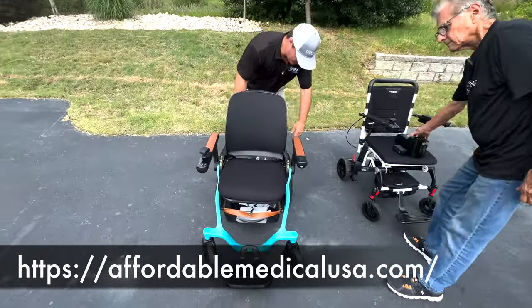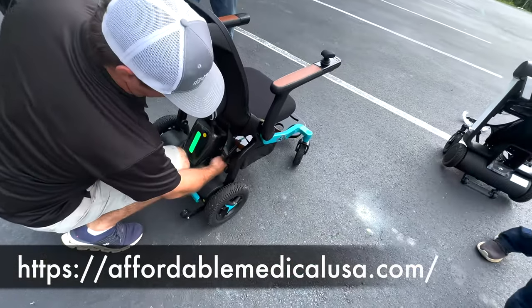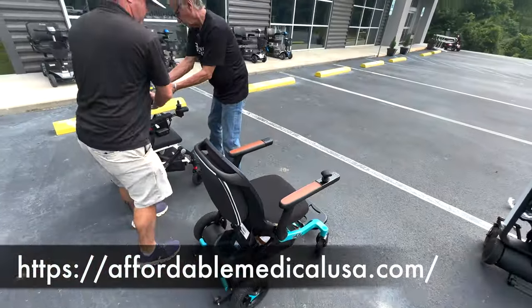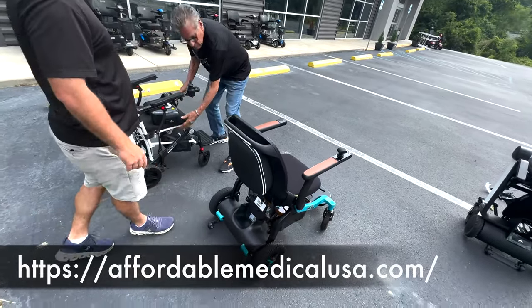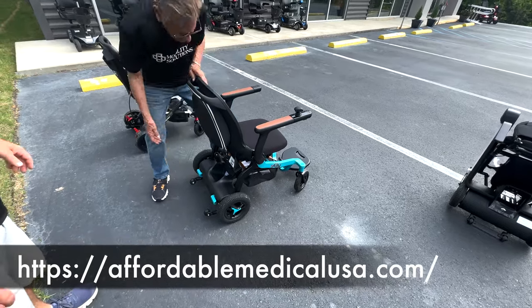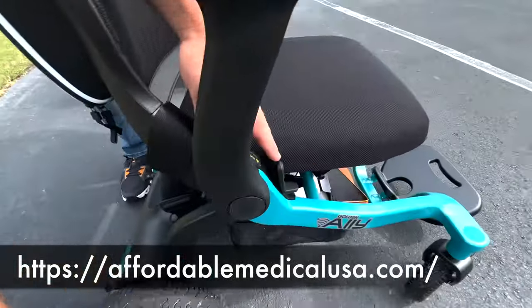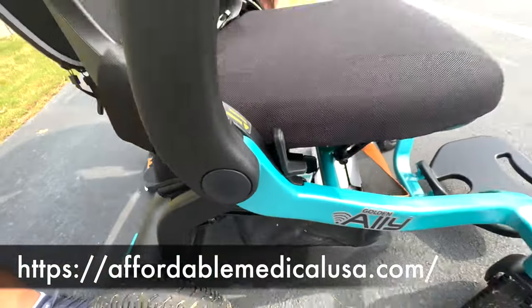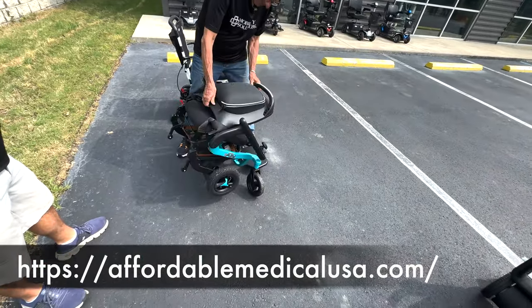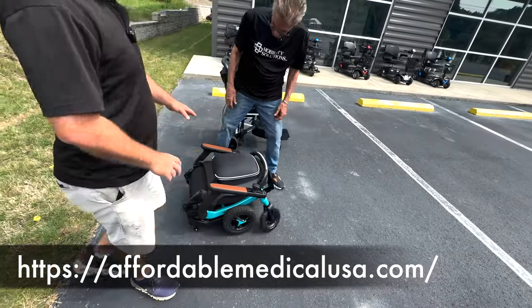All right, we're going to take the battery out. To take the battery that's on both sides, you got to go to unlock, clip it, bring it out. Just put it right there. Fold this bad boy up. Remember the hand thing? You already forgot. Hold on. Yeah, it's right here. On both sides, there's a lever. You don't have to use both, one or the other. Yeah, that was easy. Make sure it locks. It's locked.